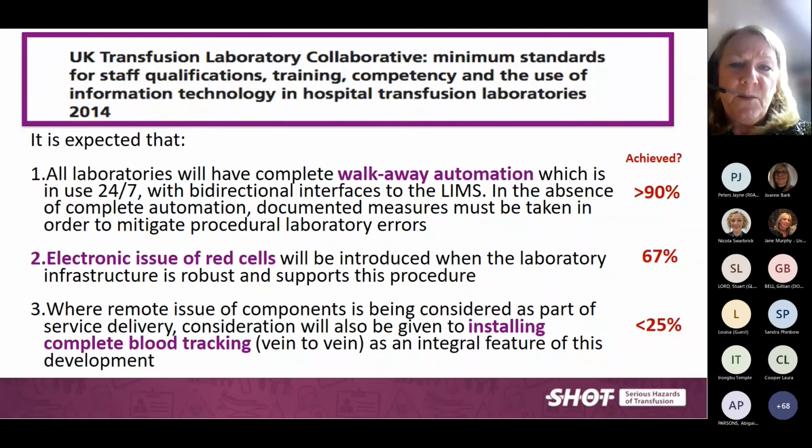Well, the UK Transfusion Laboratory Collaborative was set up to consider the increasing number of IT-related, laboratory-related errors in transfusion. And as you know, there were initially recommendations and then standards, and these are the standards that relate to automation and IT. First of all, we should have walk-away automation, which is bidirectionally interfaced. Have we achieved that? Yes, I would say the majority of people have achieved that within their laboratories.